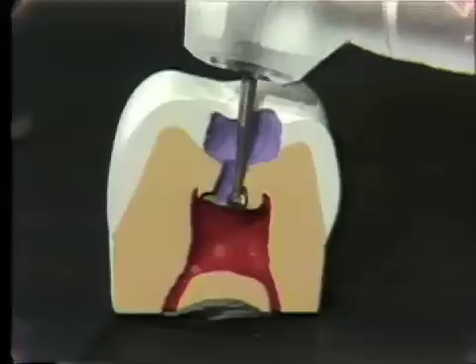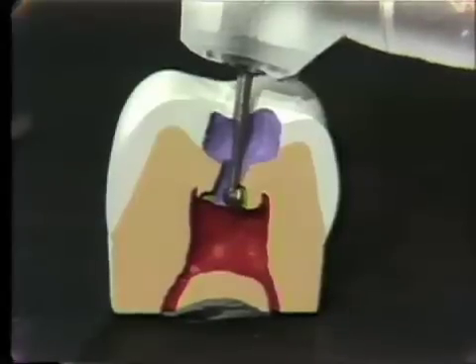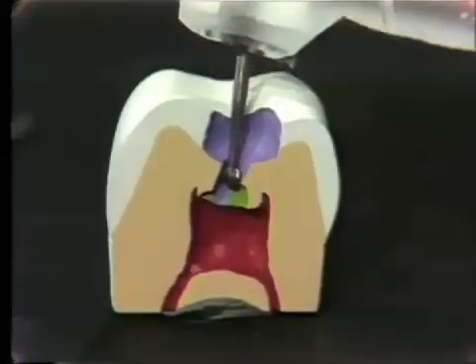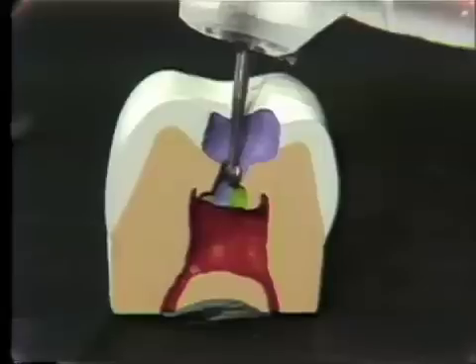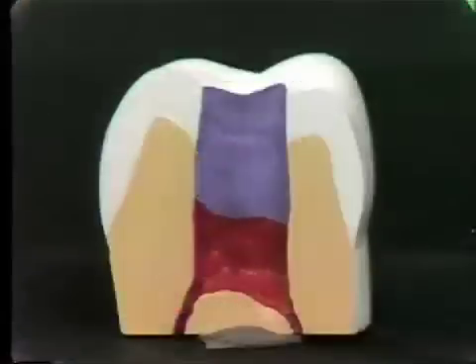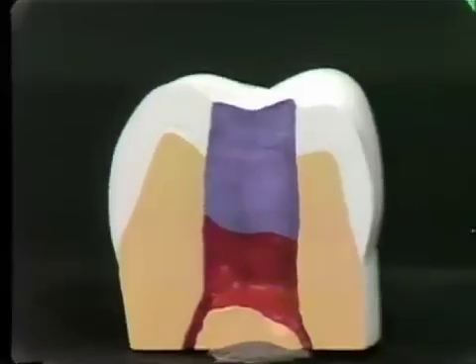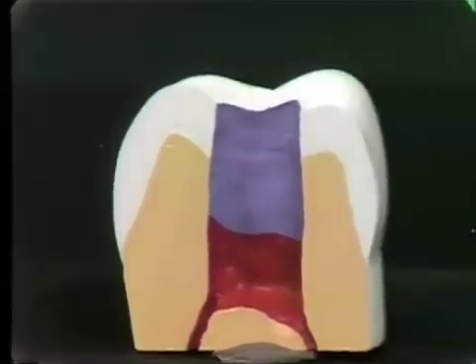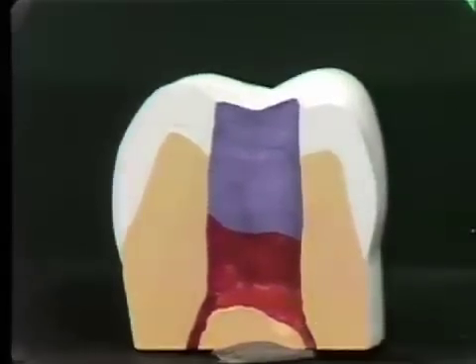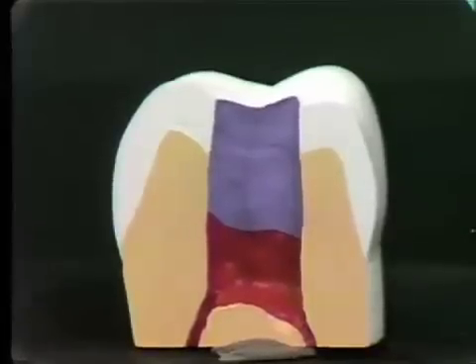Don't look for the canals right away — wait until the pulp chamber is completely unroofed, then look for the canals. In the final preparation, the chamber is completely unroofed, the floor is left untouched, the walls are left untouched, the roof is off, and the pulp chamber is clean.